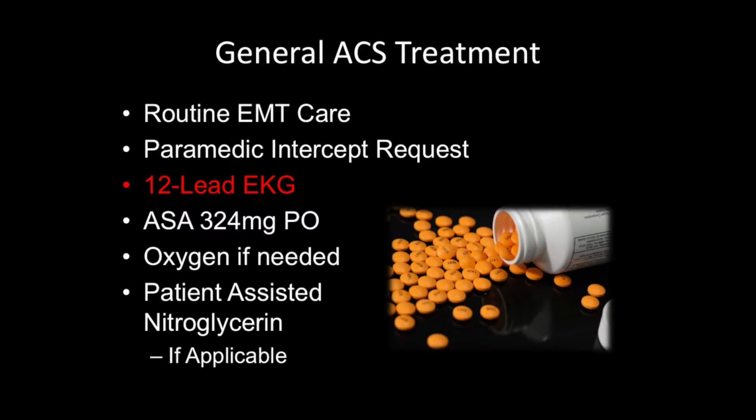A patient that experiences an MI is very much at risk to have a dysrhythmia, right? That is one of the problems that they run into. We can treat it with the AED to some degree, but a paramedic can better treat it, right? They can also do a couple more things for an MI, so we definitely want the medic there if we can. We want to perform a 12-lead EKG.